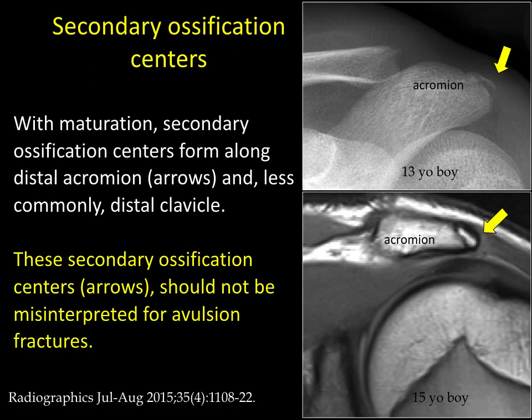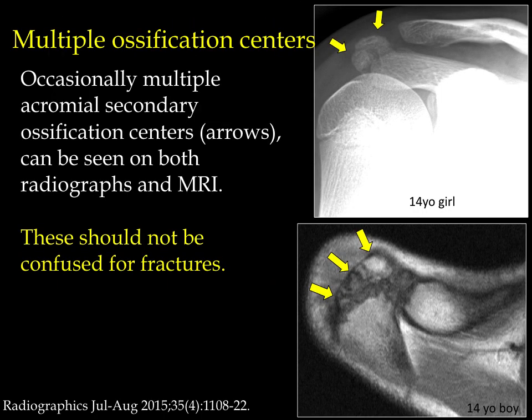Other normal variants are the secondary ossification centers we readily see in adolescents on the distal acromion. We might misinterpret these for avulsion fractures, but MRI shows us clearly that this is part of the acromion and just a normal ossification center. We can actually get a few of them, giving a lobulated appearance of the distal acromion as shown on MRI — again, a normal developmental variant.